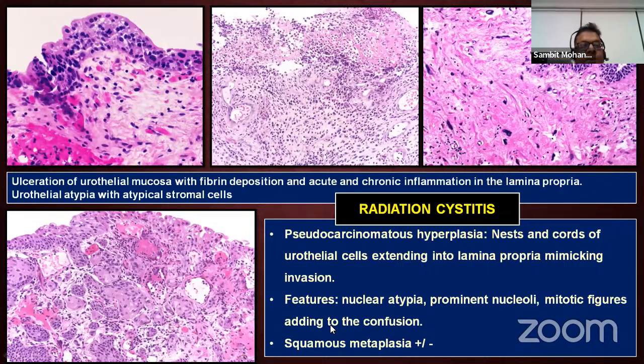So if you have this in your mind: syncytial change, cell-free zone, edema, dropping off of the nuclei, irregularity of the nuclear chromatin, but the cells have a similar hyperchromatic nucleus, a lot of fibrin, edema and myxoid change, along with foci of pseudoepitheliomatous hyperplasia and reactive myofibroblasts, think about it and talk to your clinician about a history of radiation.